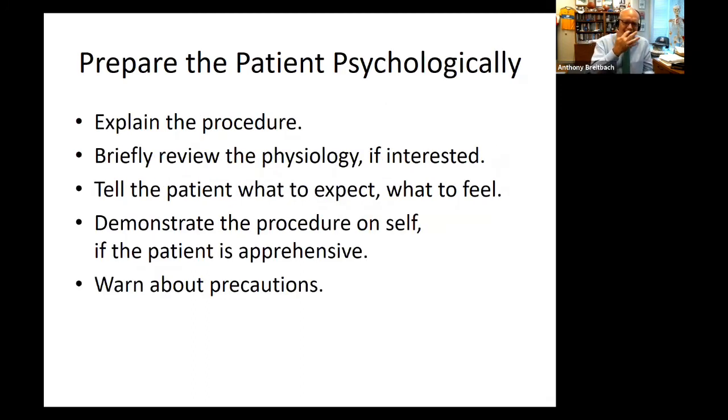Preparing the patient psychologically: explain what you're going to do. If you need to review the physiology, tell the patient what to expect, what to feel. You want to demonstrate it on yourself if they're apprehensive. So sometimes you'll stick your finger in the paraffin bath or something like that. And then warn about any precautions. So, okay, if it starts feeling like it's burning, you tell me because we're going to get you taken care of right away.